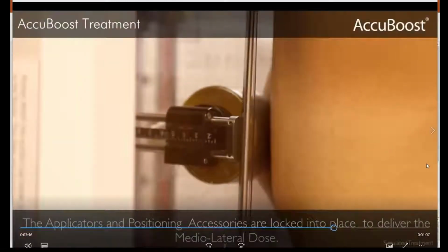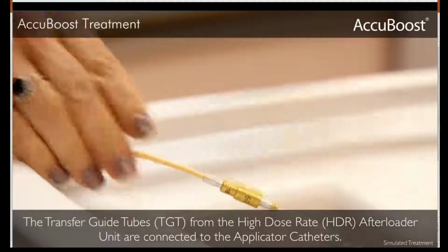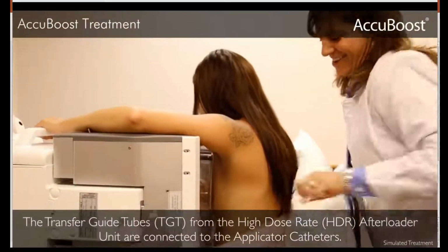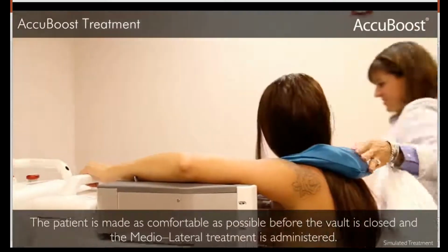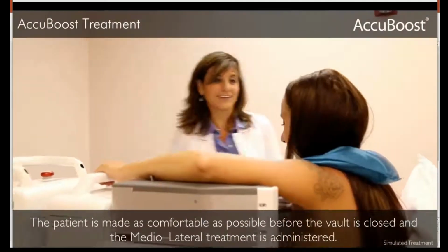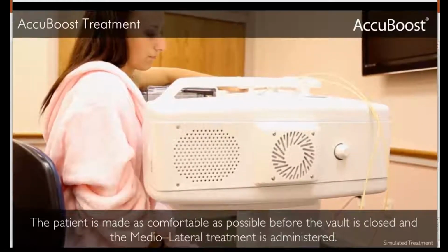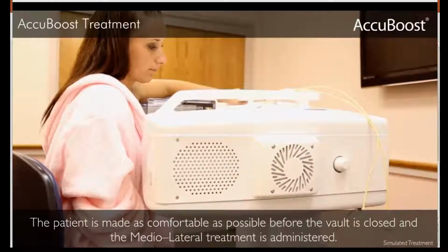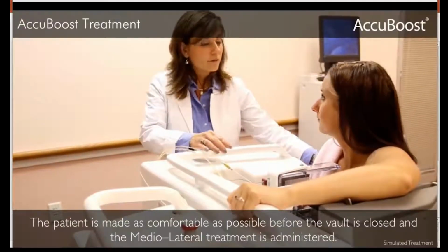And the patients are generally very comfortable during this time period. We ask them to hold position, which they are readily able to do. And as you can see, we do what we can to make the patient as comfortable as possible here for a period of about, the total irradiation for a boost process takes about 17 to 20 minutes.